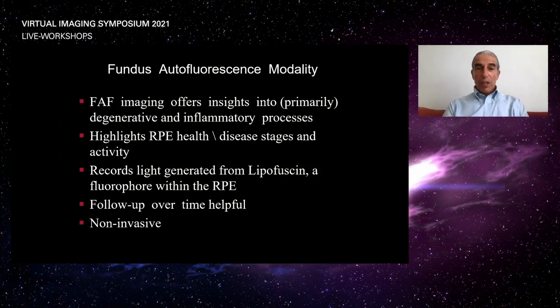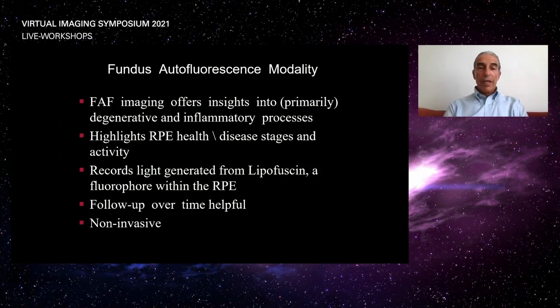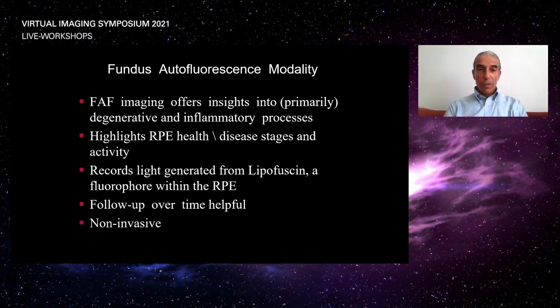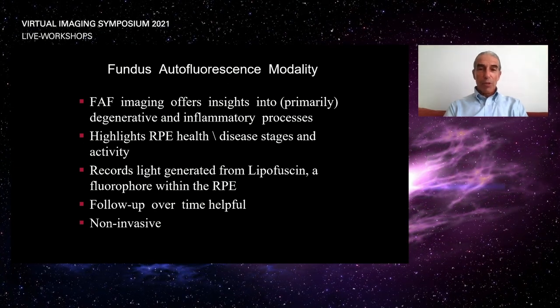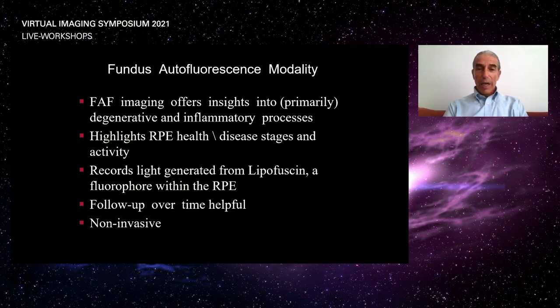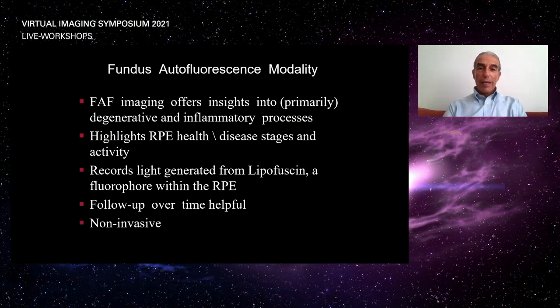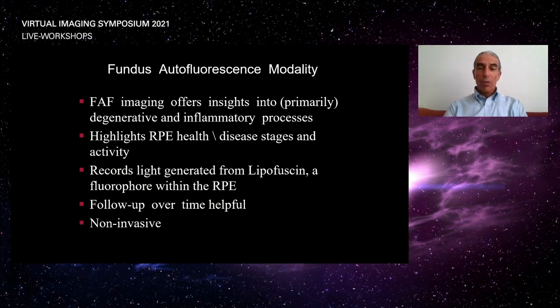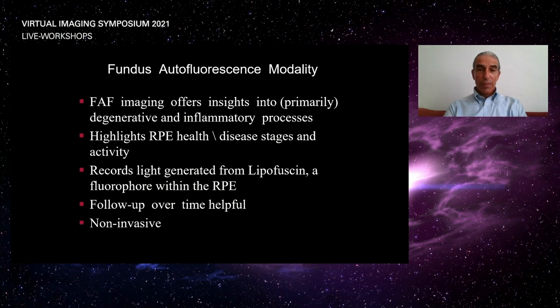So, autofluorescence modality. For many years, it's received a lot of airtime, and justifiably so. I find it a fascinating imaging modality which adds a lot to our understanding. I'll show a couple of cases to use as a kind of primer, if you will, an instruction book on how to use and understand autofluorescence.